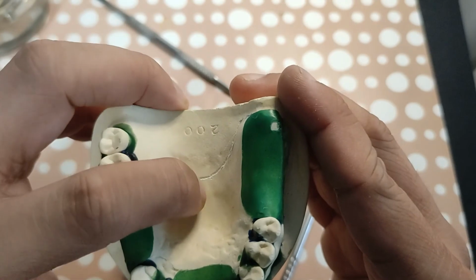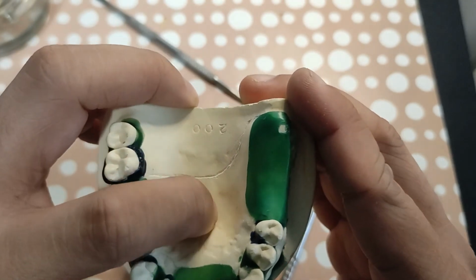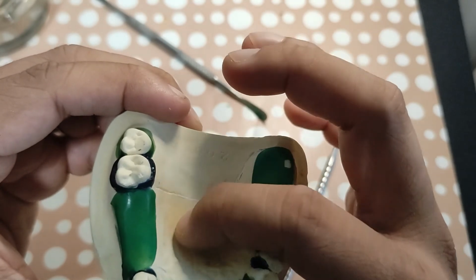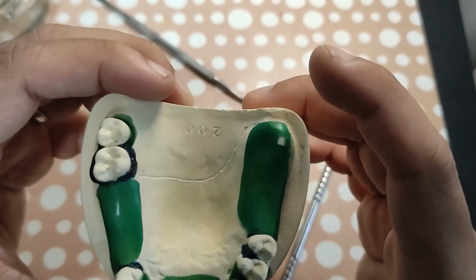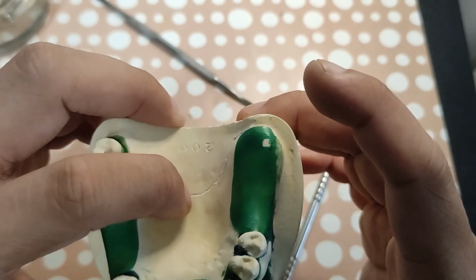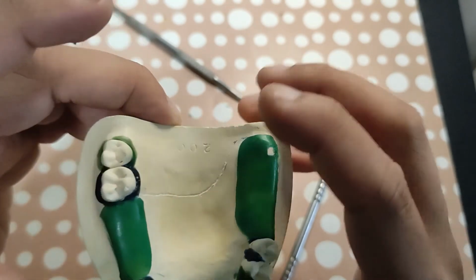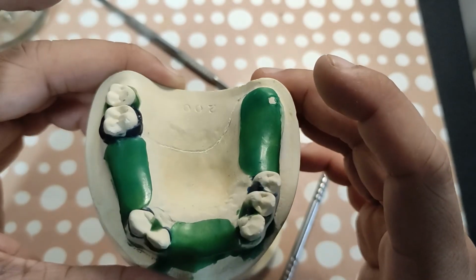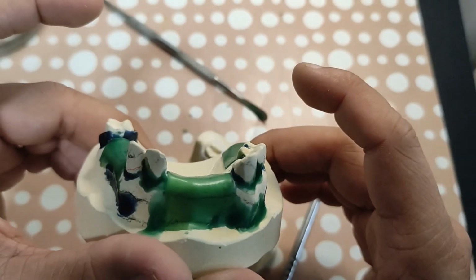I could have avoided the median palatal raphe, no? Kasi dapat hindi siya nagbe-bear ng any scoring, but since it's not prominent, it's okay, no? Nag-bead tayo past the raphe, or across the raphe. That's fine. Okay, so those are the two.